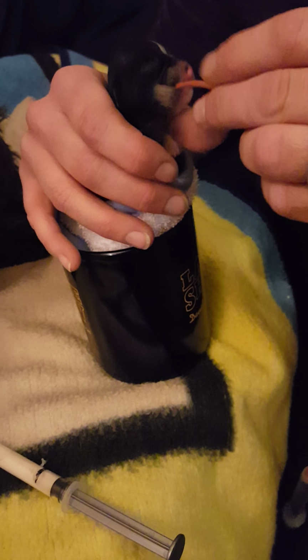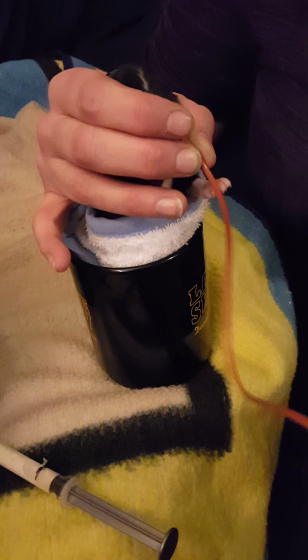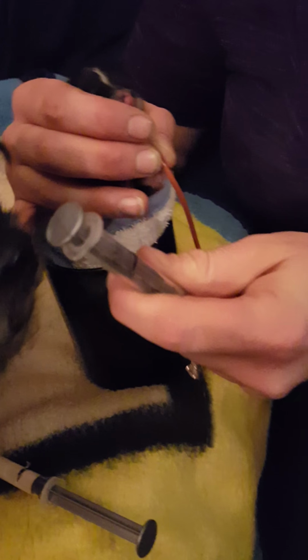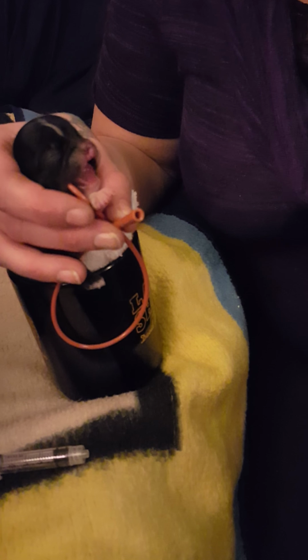Little swallow. Well, she doesn't like it. Gotta make sure. Yep, it's in the right spot. One second. There's a little suction, which means it's not in her airway. It's in her tummy. And we connect this. Just test it again. Okay, it's not bad. We just gotta make sure we got the right amount.